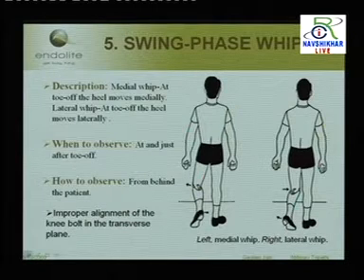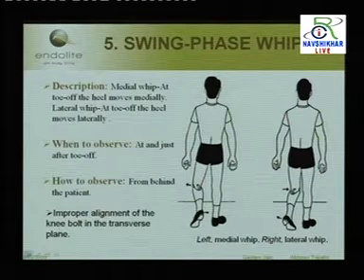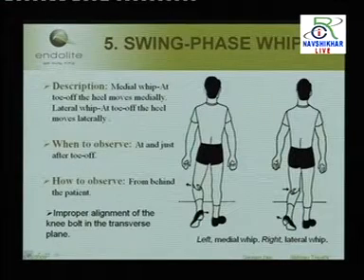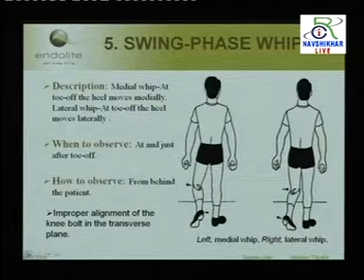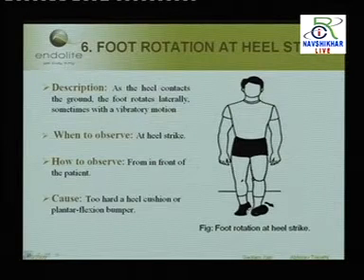This particular one we see from behind the prosthesis, so that we can see the angular movement of the complete prosthesis. Only from behind or from the front as well? Front also we can see. We can see the lateral or medial movement of the foot ideally from behind, but we can also observe it from the front of the gait. So this also has different reasons.